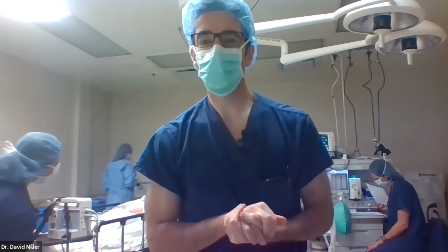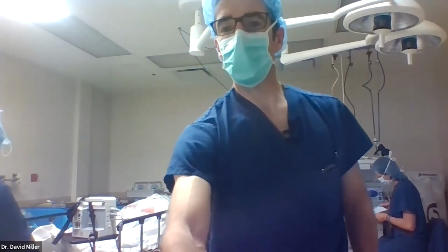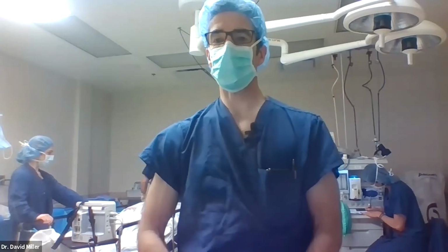Okay, here's a question, let me just load that. Which is better, an iatrogenic break near the disc, more posterior where the fluid accumulates, or at the anterior retina? So here we're talking about where the retinotomy was created. Do I make a retinotomy down by the optic nerve or in the periphery? And here's the problem. So when you make the retinotomy in the periphery or drain through the original retinal break, you can do that. That's a more skillful procedure.